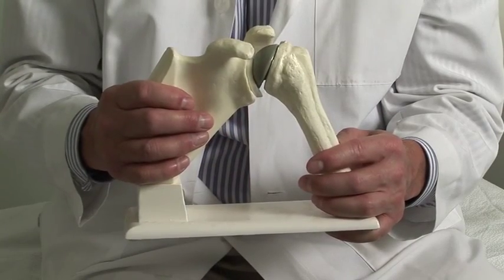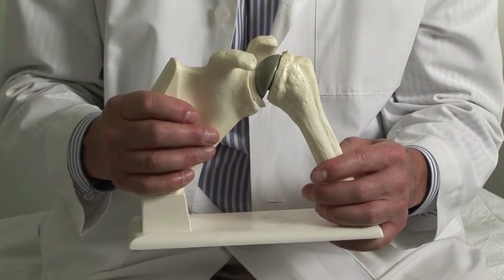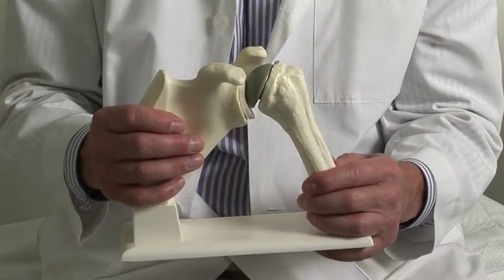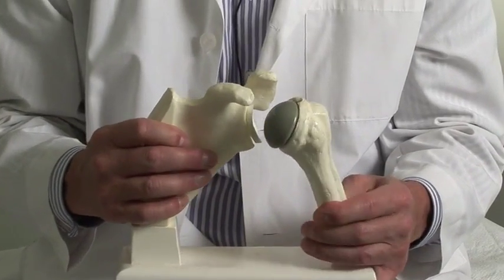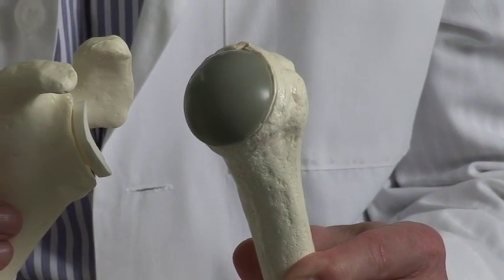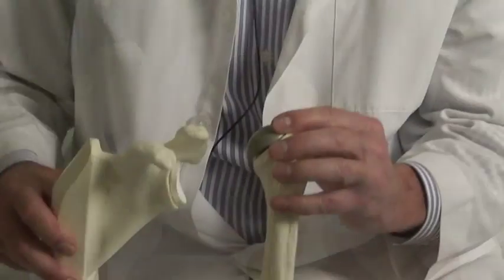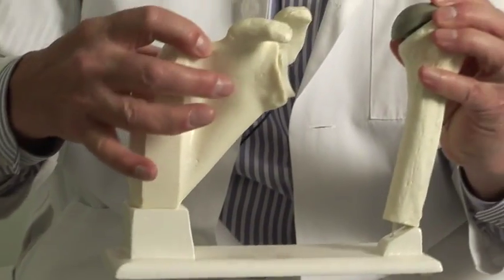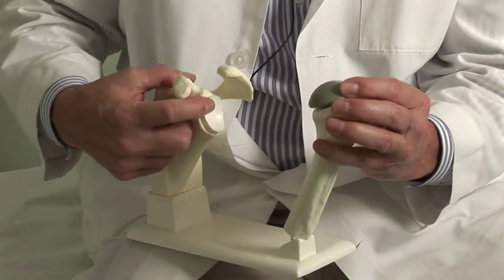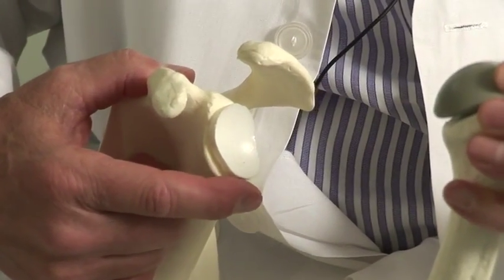So a shoulder is a ball and socket joint, and this is a model of a shoulder, the bony anatomy of the shoulder, and what the prosthesis actually looks like. The ball is on the arm side. This is your upper arm, your humerus, and this rounded structure here, you can see, is the ball which we'll be replacing. The socket is actually part of your shoulder blade, which is this structure here, and this small semicircular part of the shoulder blade is actually the socket.